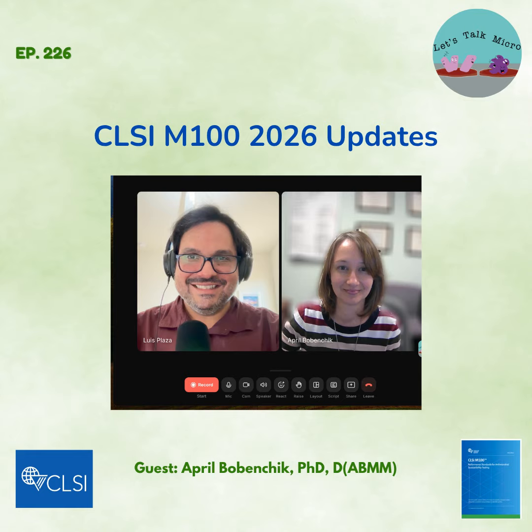So, if you don't have an opportunity to get on the webinar or read anything from the CLSI website, definitely check out that overview of changes section at the beginning of the document. Take some time to sit down with your supervisor, your lead techs, maybe a pharmacist or ID doctor, if you have access to a team, to strategize on what you need to do first. What's your low hanging fruit? If you're an institute that hasn't had Acinetobacter isolates for the last 3, 4 years, so you never need it on your antibiogram because you didn't have enough isolates, you may not think about doing your aminoglycosides right away. If you're CAP accredited, though, you do have a time period in which you have to eventually update those breakpoints. But that would be one of my strategies.